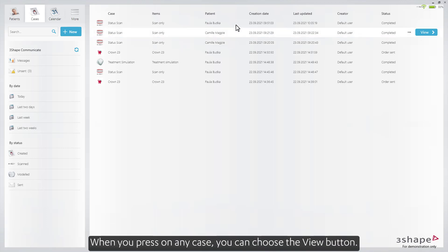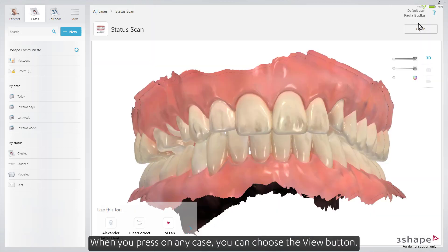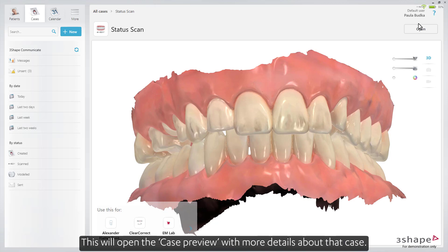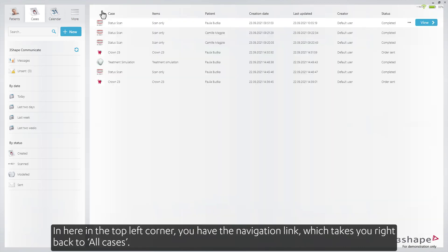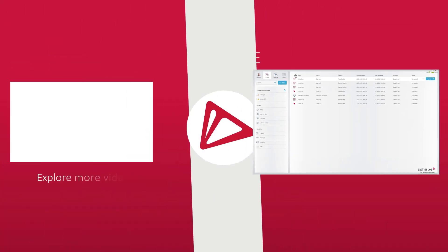When you press on any case, you can choose the View button. This will open the case preview with more details about that case. In here, in the top left corner, you have the Navigation link, which takes you right back to All Cases.